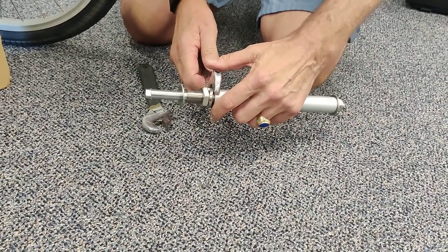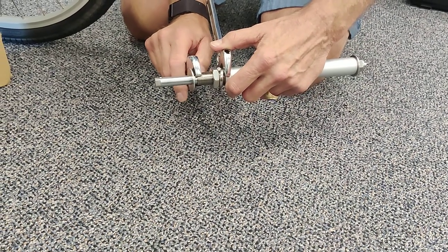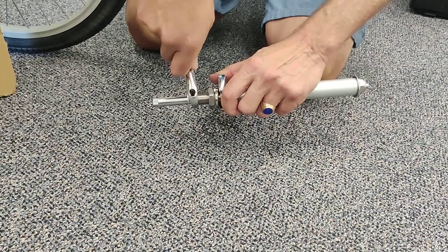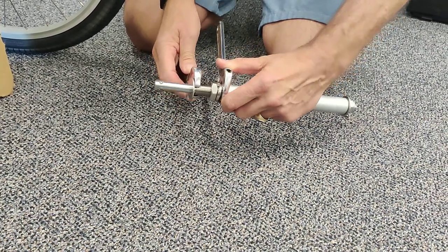Do that by using a wrench on the flat spot on the axle body and a wrench on the threaded portion. That will spin it down and lock it.